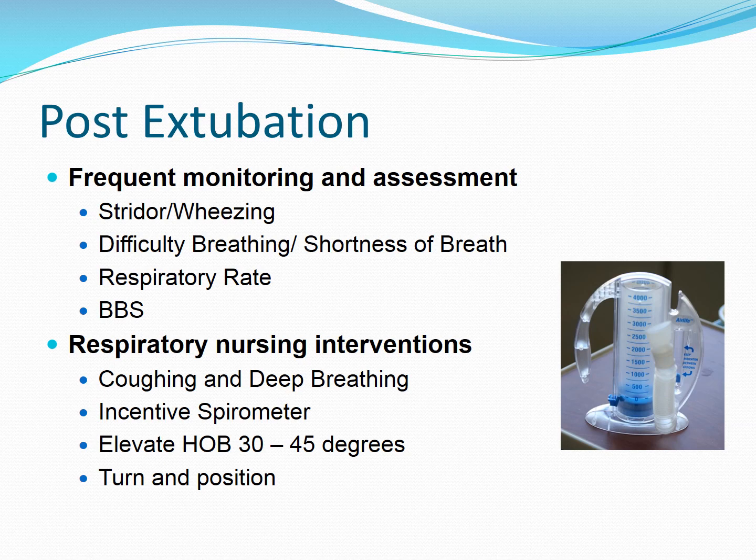When you use an incentive spirometer, the first thing you need to tell that patient is to blow all their air out, put the mouthpiece in their mouth, and inhale slowly. When they can't inhale any higher, tell them to hold it for a second, remove the mouthpiece, and let the air out. Incentive spirometers should be given on any patient that's in a hospital.